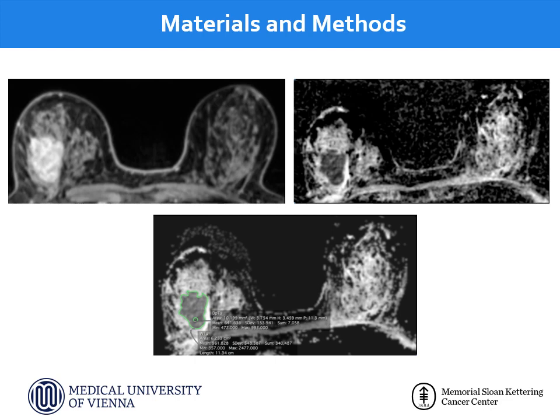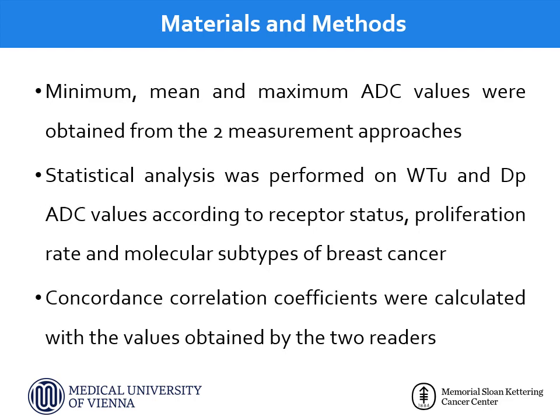Here is a case example of the two ROIs drawn on the whole tumor and on the darkest part. The minimum, mean, and maximum ADC values were obtained from the two measurement approaches.